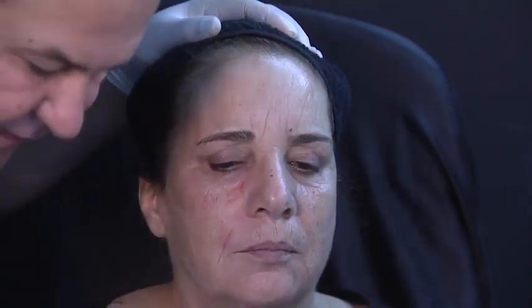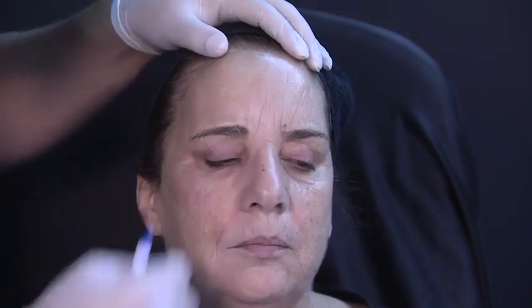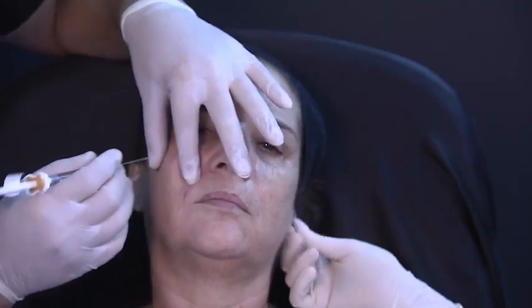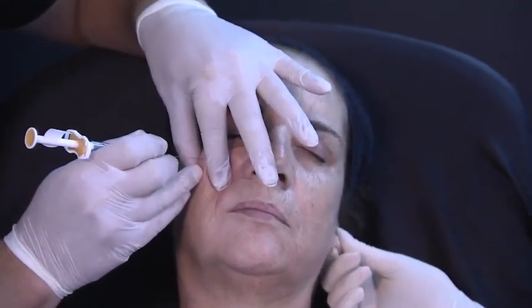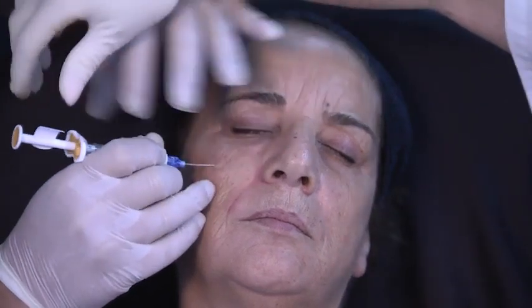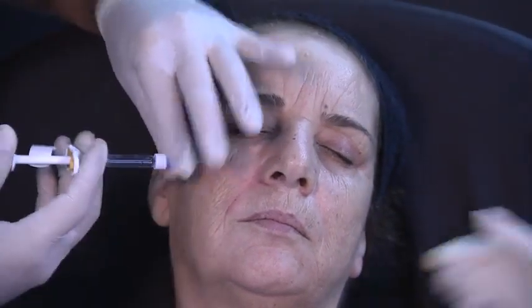Sometimes, remember, I see this. When we treat the teardrop, sometimes we have a hollow here. This area may be a little bit hollow, okay? So when I have this, I normally have my Vital Light that I have used for the teardrop, and I can do a superficial deposit there. I'm going to try to do it for you.